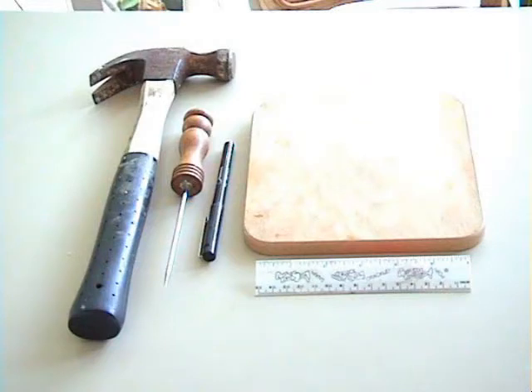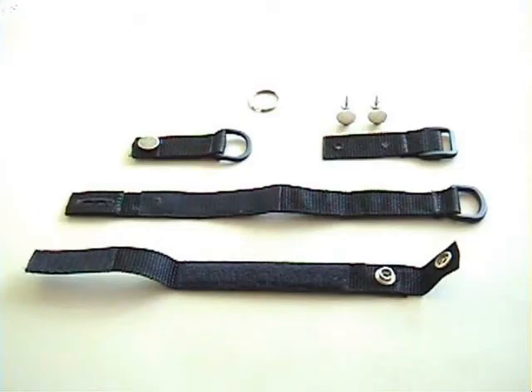Tools include a hammer, an awl or ice pick, a pen, a ruler, and a hard surface such as a cutting board. The package includes four manufactured belt pieces plus two buttons, two anchors, and a zipper ring. The pieces with Velcro can be removed for the purpose of laundering, which extends the life of the Velcro.